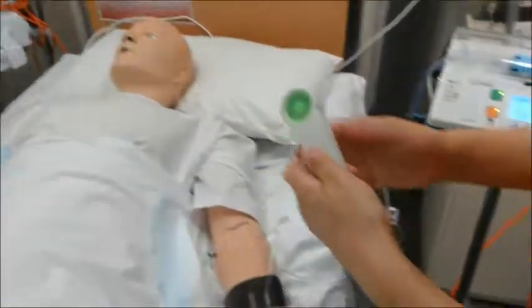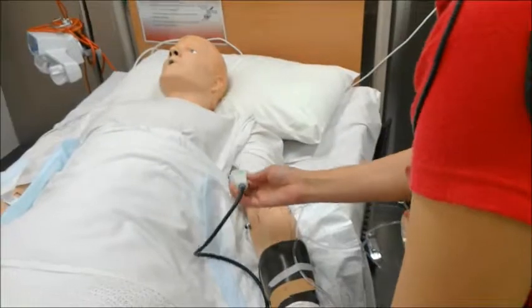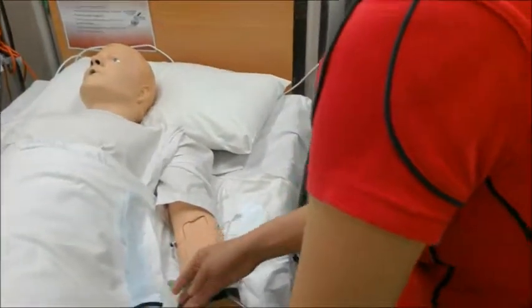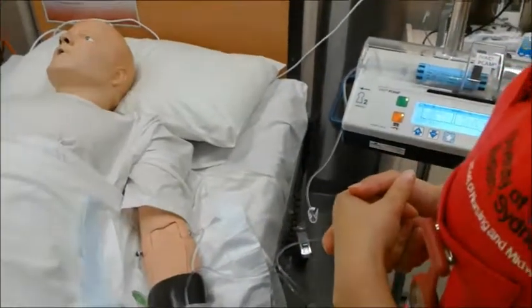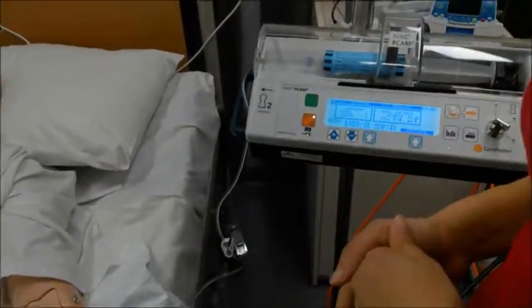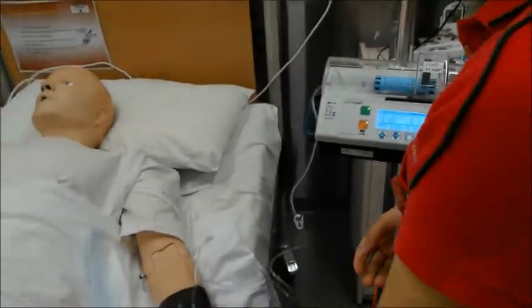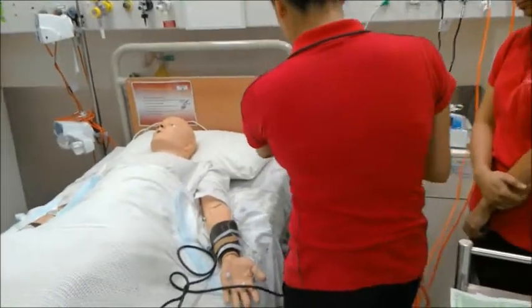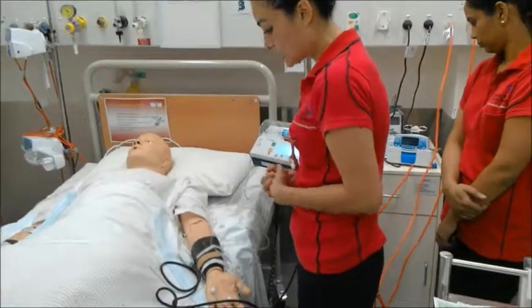I will just leave this buzzer here for you. Also I'll let you know that this morphine can cause constipation, drowsiness, and nausea. If any of these symptoms occur, just let me know and I'll come and check you. Also I'll come back around 15 minutes to check on you. Here's your buzzer. If you need anything, you can press your buzzer. Your PCA is going through now. I'll be back within 2 minutes to check you. Thank you so much, Mrs. Adib.